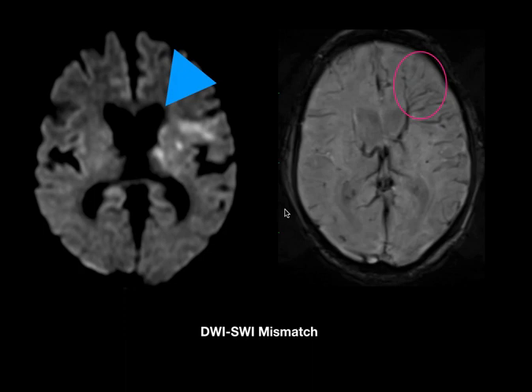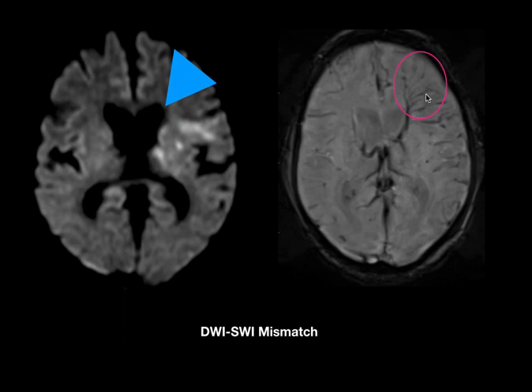This region of brain which is not yet showing diffusion restriction, but on SWI you can see a lot of prominent veins with increased hypointensity of the vessels. There is no diffusion restriction but still there is an increased voxel count of the number of vessels as well as increased hypointensity of the vessels, which suggests diffusion susceptibility mismatch.